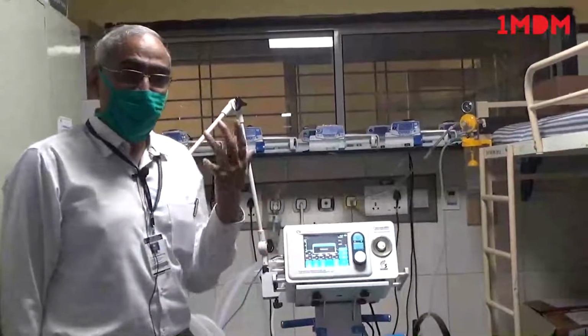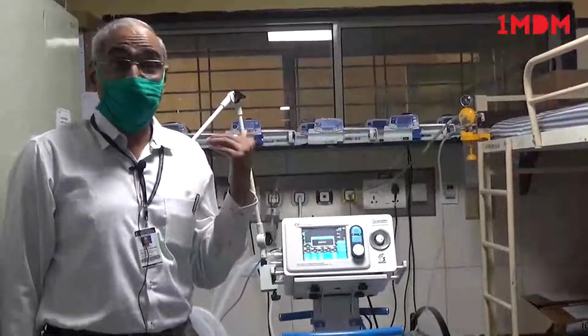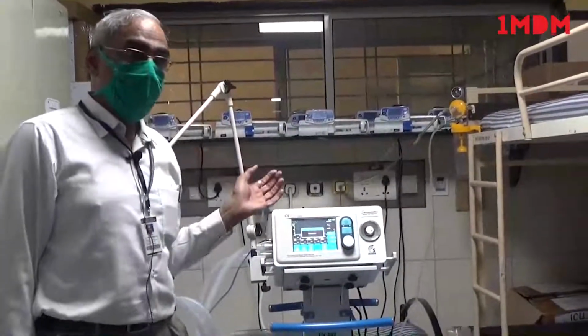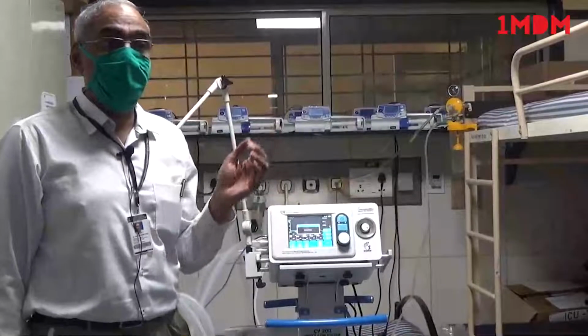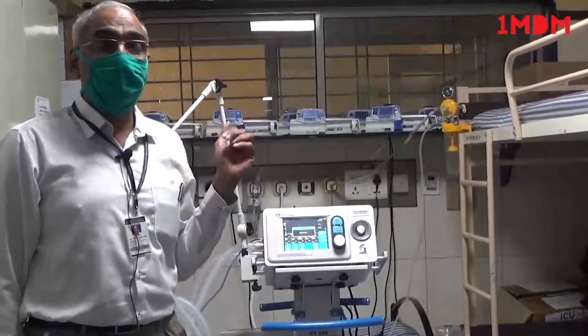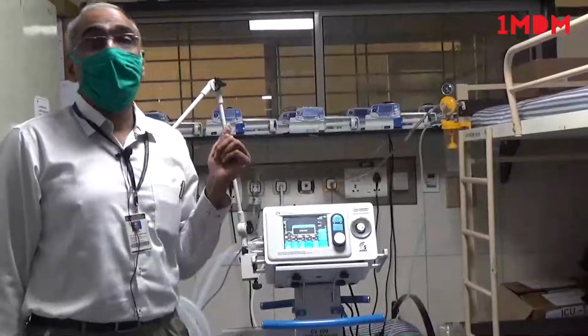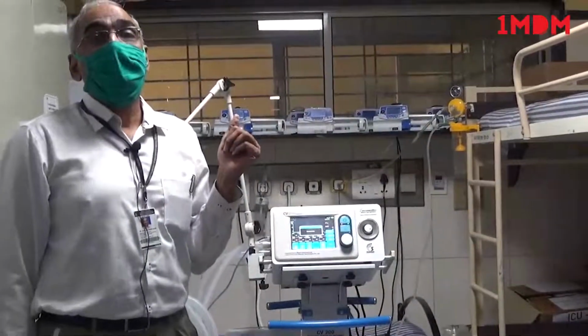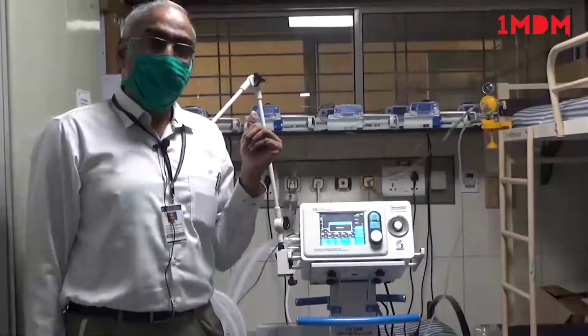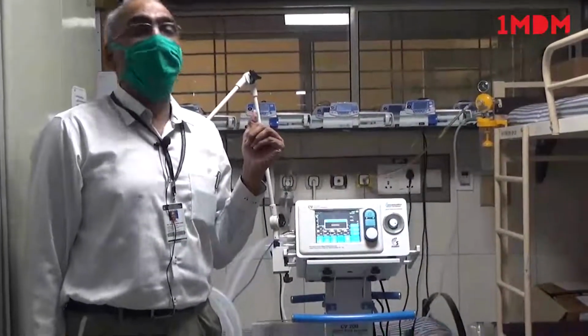So once I make it 100%, then I begin to look at the ventilator. Now on the ventilator, if I find this is pressure control, then pressure is not going to go above a particular limit. So in this case, pressure is 15, PEEP is 10. So it's not going to go above 25. So the pressure alarm is not going to go off. So here what is likely to go off is the low minute volume alarm. So if the low minute volume alarm goes off, then I need to find out why.